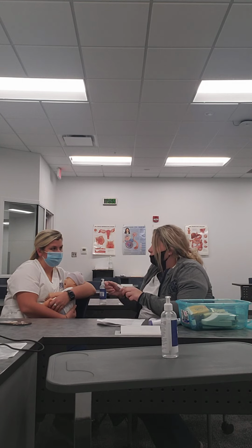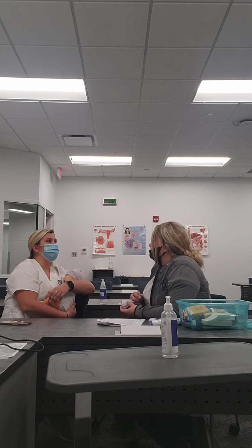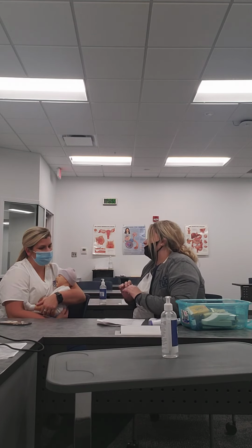And then 4 years and older, by the age of 4, most kids can hold a digital thermometer. So, you know, just have them do the oral. Yeah, take it out. For the rectal one, do you use anything prior to inserting it? No, you don't. Like, you can lube it. Yeah, that's what I meant. Okay. Yeah, you could put some lube on it, but I'm like, if you're using any rectal medication. Oh, no. Don't do that. Okay. But yeah, I would suggest lubing it. Okay. It's not very pretty. Yeah.